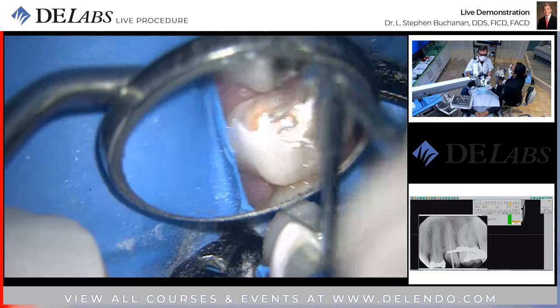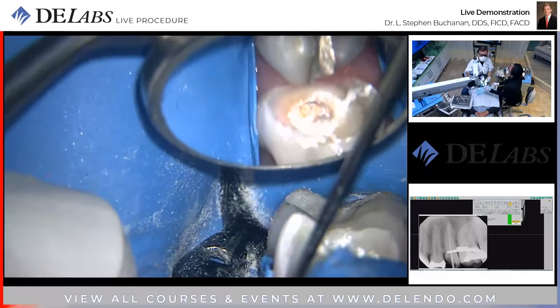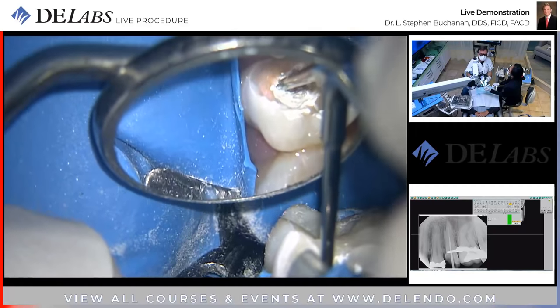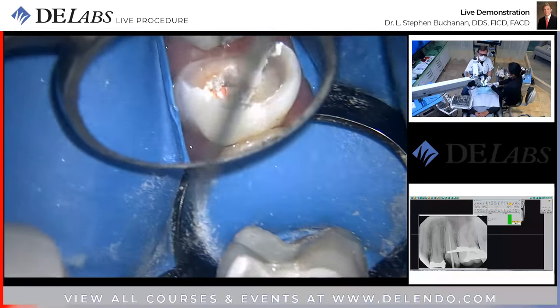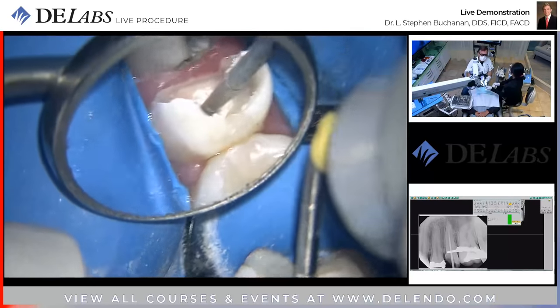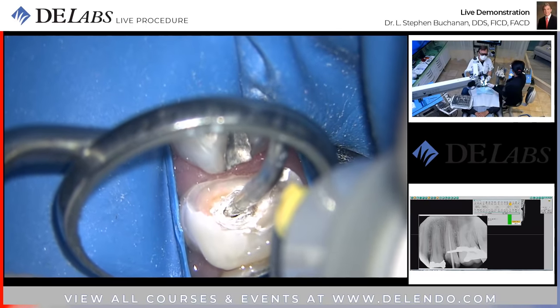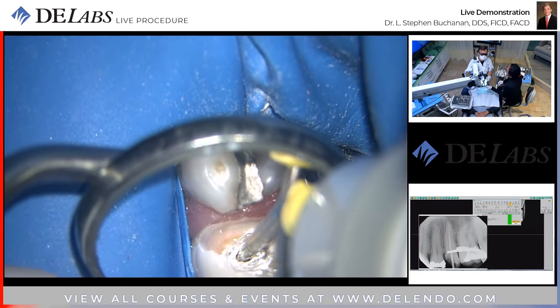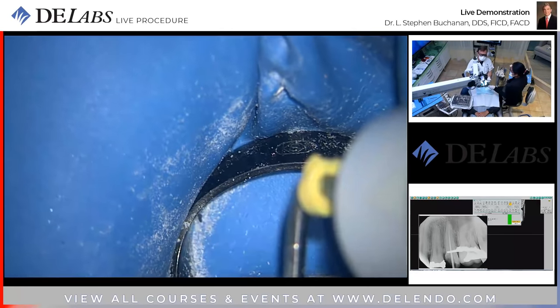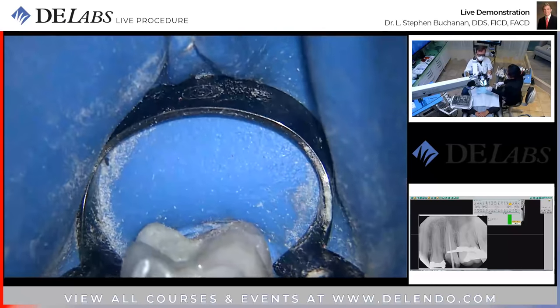I'm gonna shove this down here. We're probably gonna have it collapse a bit. That's why I threw the second cone in place. All right. This is the shortened down pack for continuous wave now. Sorry, I should have warned you. Hear a beep, I'm gonna rotate this. Usually I will put an instrument right at the crook there, helps it pull straight out.